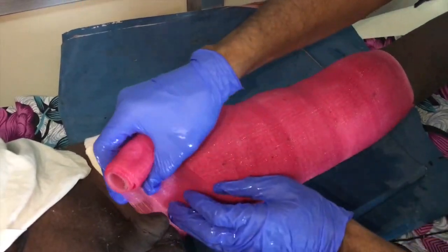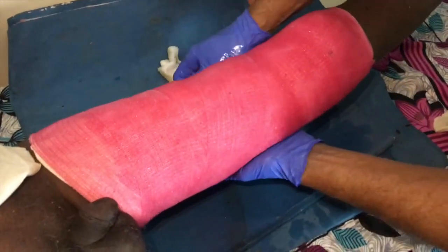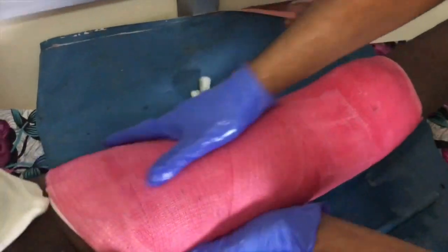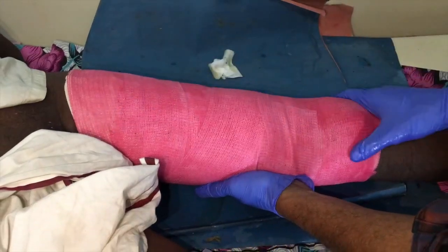The final cylindrical gaiter extends from the groin to a little below the knee and is contoured to the body, helping to ensure that angular and rotational deformities are prevented during weight bearing of the patient.